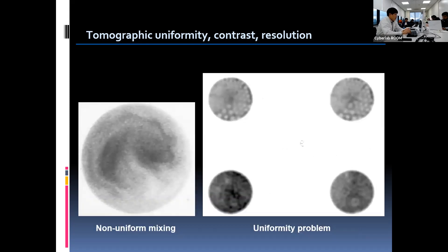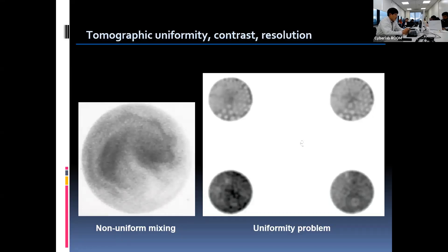These are examples of bad case phantom studies. The left image shows non-uniformity since the technetium solution was not mixed well with water when preparing the phantom. The right image indicates that the camera system has uniformity problems and significant loss of resolution. In this case, acquiring a high-count uniformity correction map might be the solution.